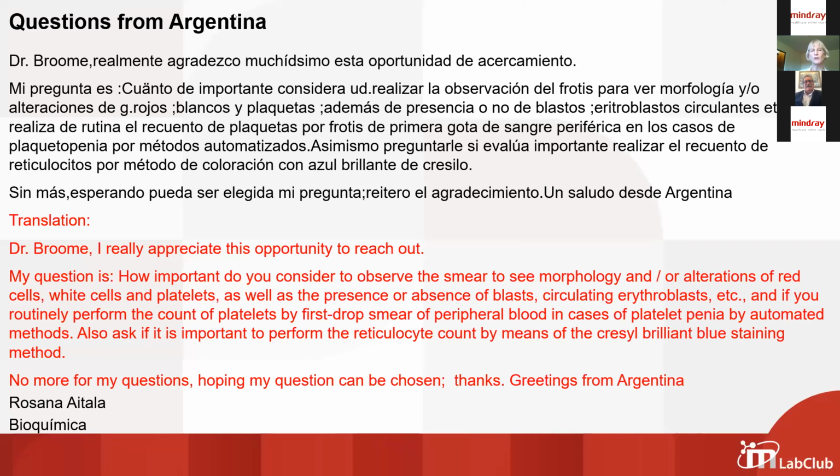I would have to do some research about whether people have come up with a percentage cutoff for that. I will say that the spherocytes that are significant are generally smaller and hyperchromatic, so you would look for that. That might help you. I also don't know about the cutoff for spherocytes in newborns. I don't know either. Okay.